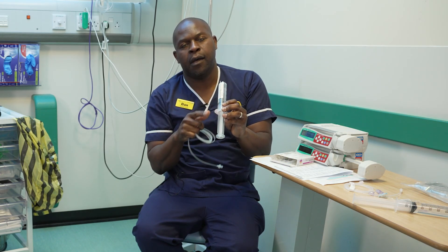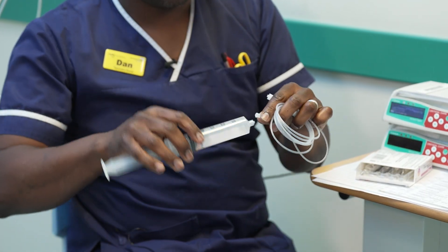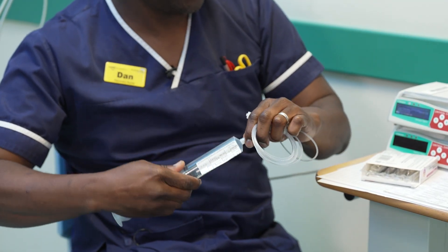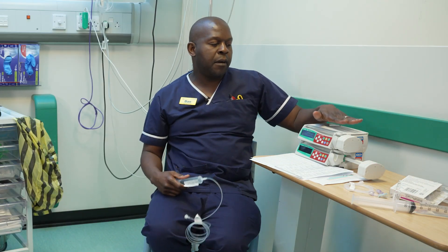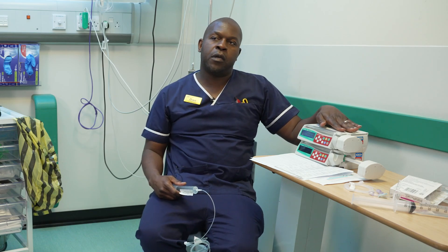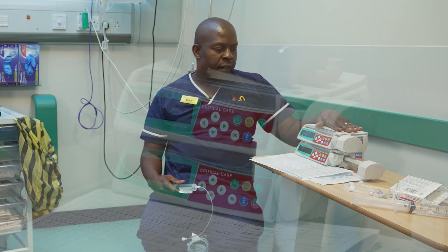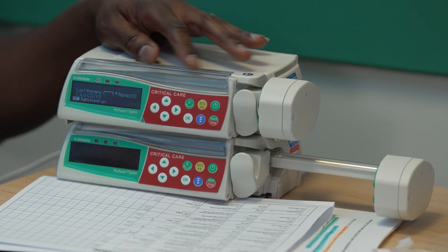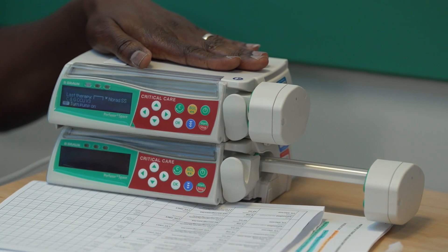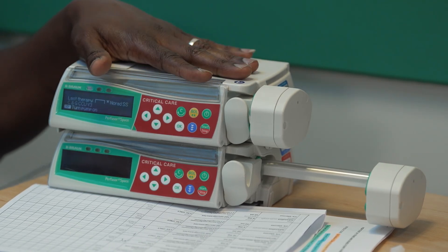This is the infusion that you've drawn out — make sure it's labelled. Then you need a giving set just like this, and you connect it here. For the infusion, you need a pump like this. These pumps you can borrow from the intensive care unit — you cannot use any other pump as these are especially designed. These pumps have a drug library in them and they will say 'critical care.' They are user friendly and do everything for you.